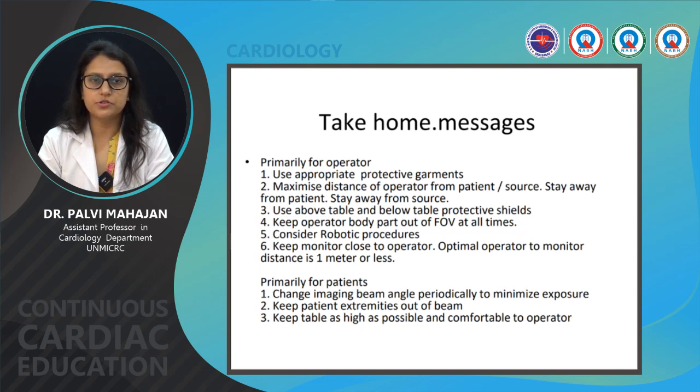Primarily for the patients, change the beam angle periodically to minimize the exposure. Keep the patient extremities out of the beam. Keep the table as high as possible and comfortable to the operator.